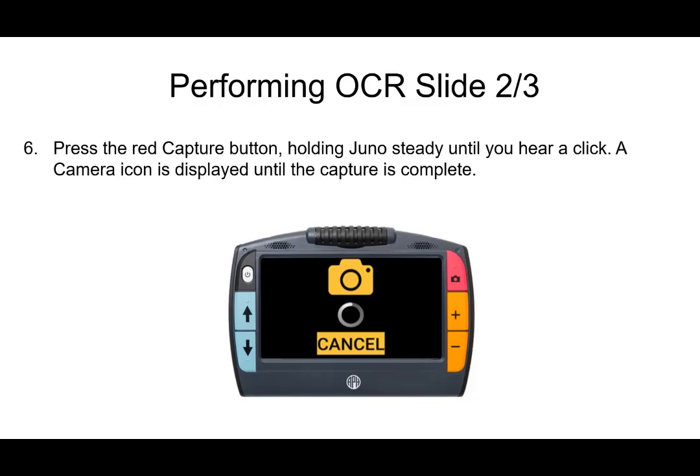Once you have it lined up in the window, press the red capture button and hold the Juno steady — do not move it until you hear a click. A camera icon will be displayed until the capture is complete. Don't move the unit until after the capture is complete, because you need to give it enough time to focus and then take the picture. It takes just a little longer than you might think, but it's really not terribly long. Just make sure you don't move the Juno until you hear the click.